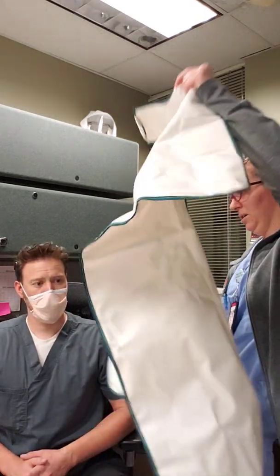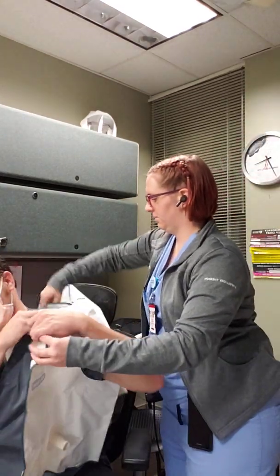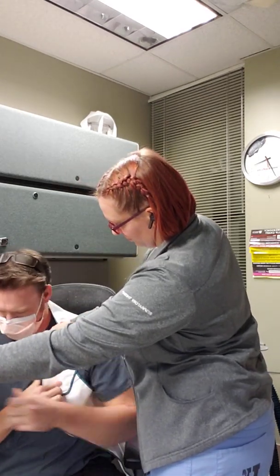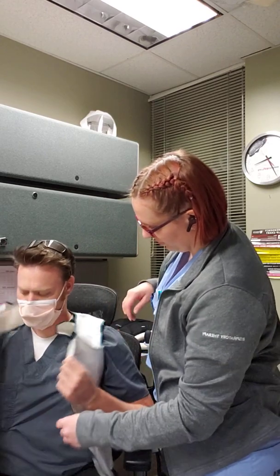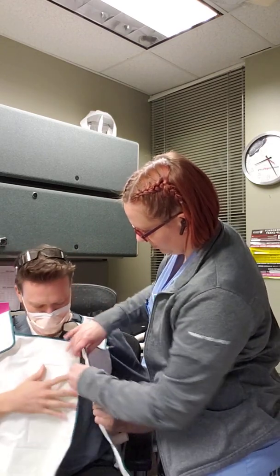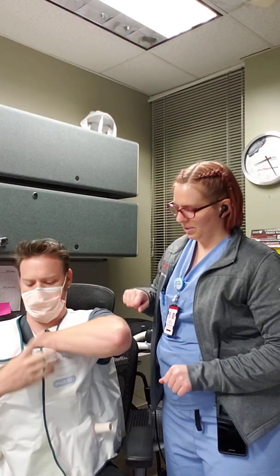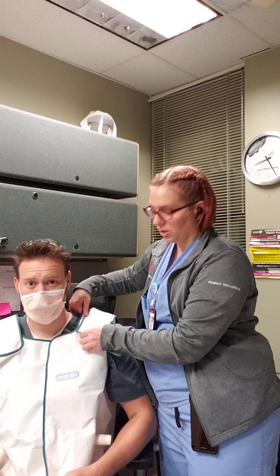The patient puts on their vest. Oh man, I have it backwards. We put it on, and then we make sure that he's able to stick a fist distance between himself and the vest. That's how you fit it. You will see down here, these are all with Velcro. You want to make sure nothing's going to rub or cause any type of skin irritation.